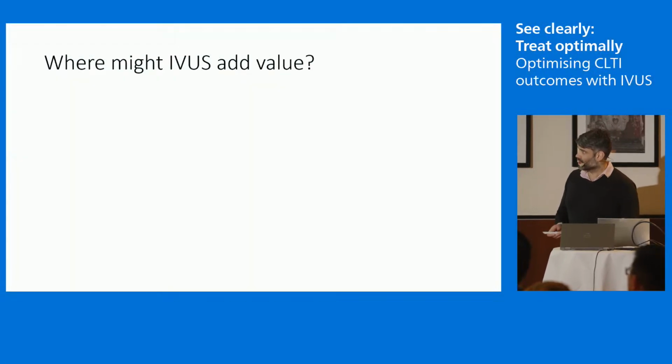We won't talk about blood speckle and non-uniform rotational distortion because they're not a feature with Philips IVUS.